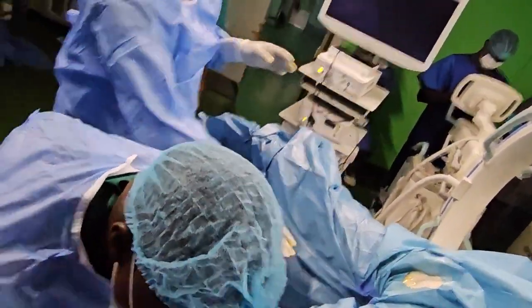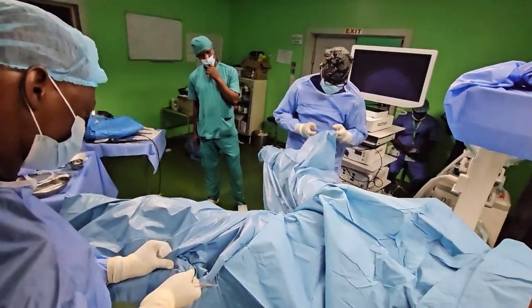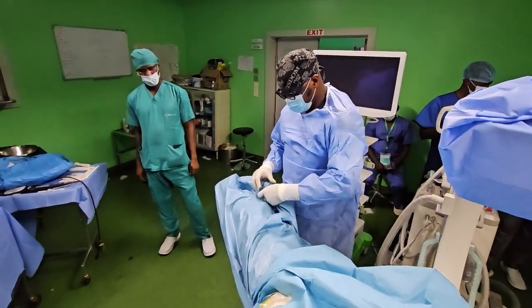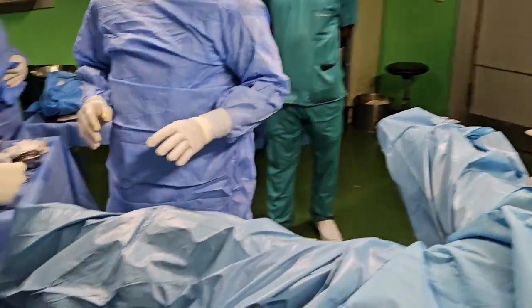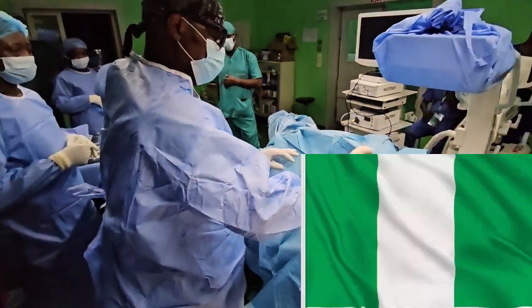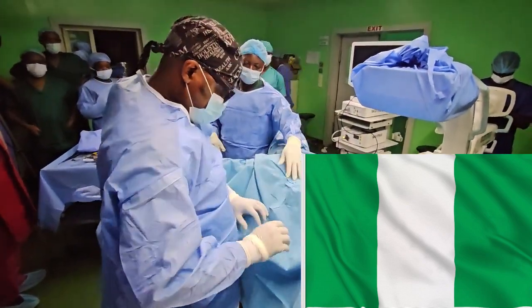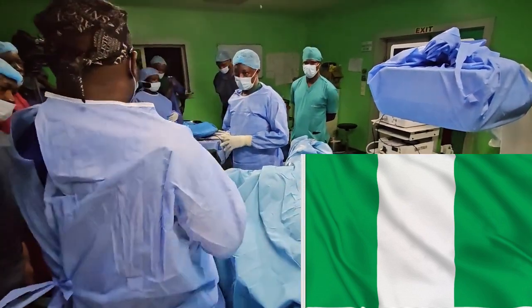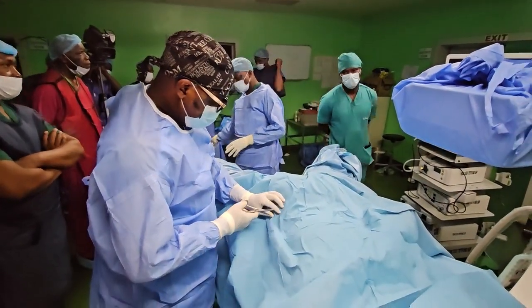So the phallus is, so we don't pull, we just drape this way. So with this, the handcuff, we then spread the drape. That's just the cut so that we can easily palpate our landmarks.